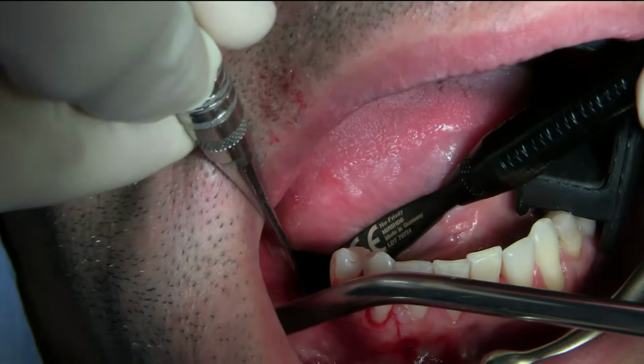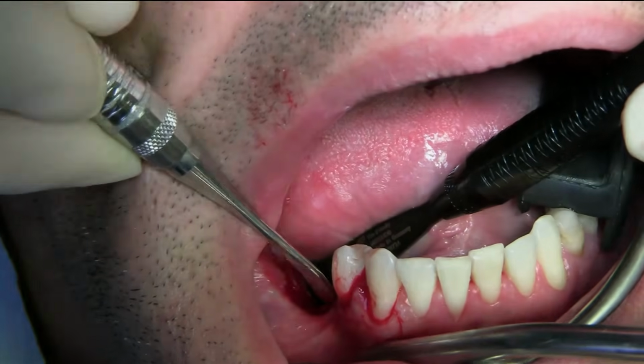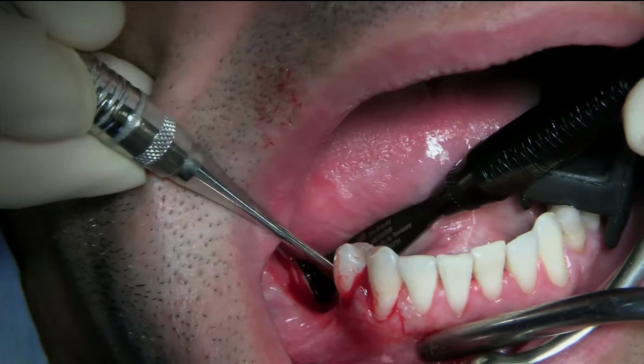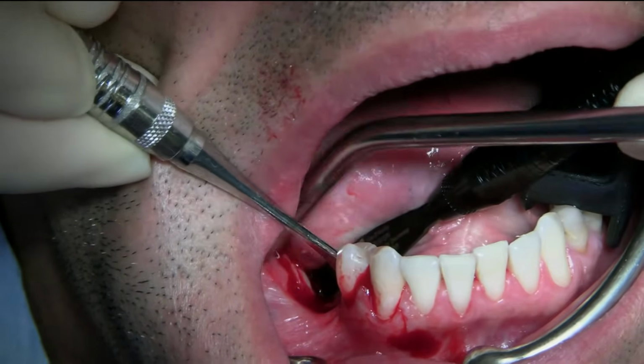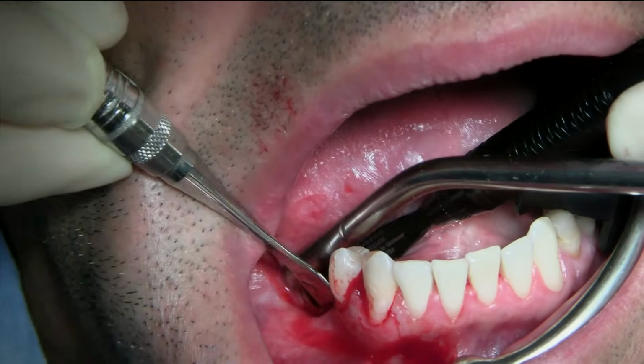I'm dipping into the biggest part of the vertical. Suction.